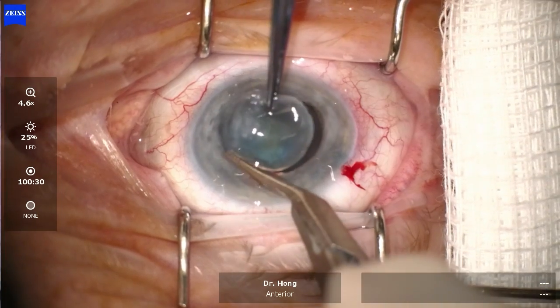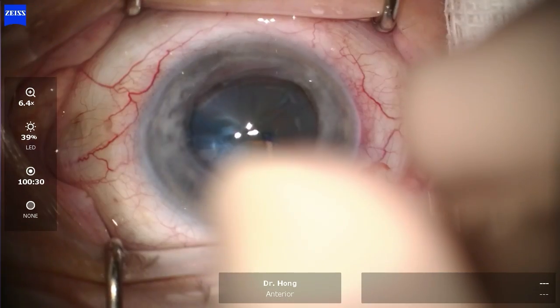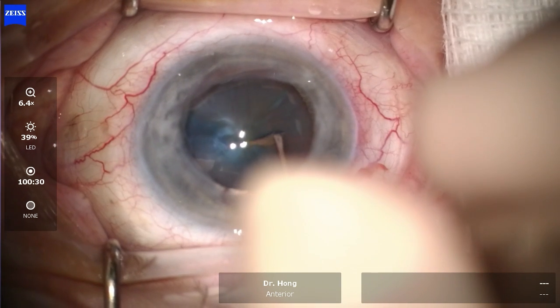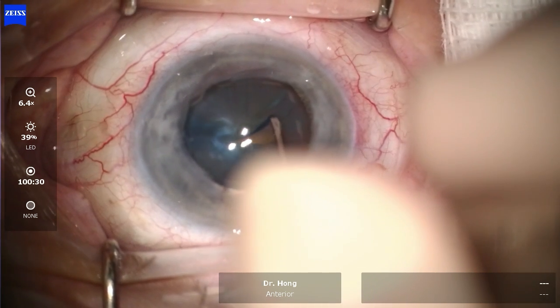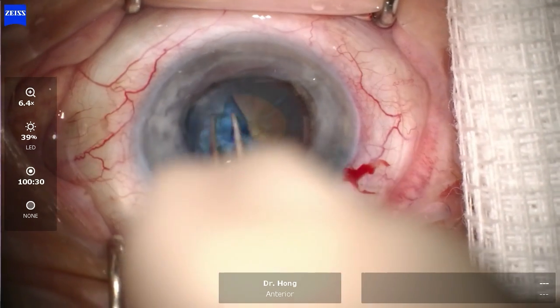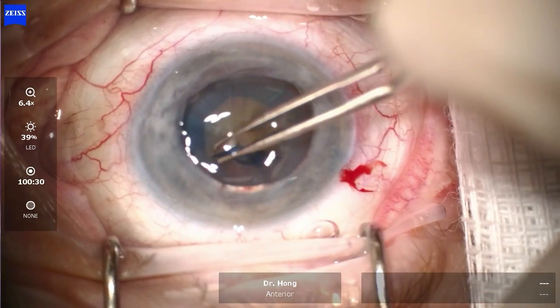As you can see, the anterior capsule of the cataract was initially stained right at the beginning. Using a cystotome, a little flap was then created. The aim is to create a large continuous capsular rhexis so that the cataract can then be prolapsed.